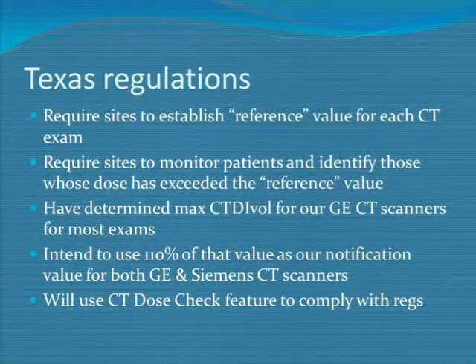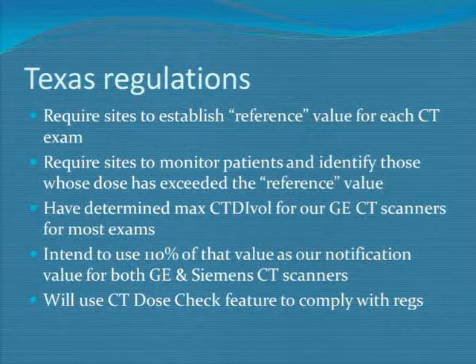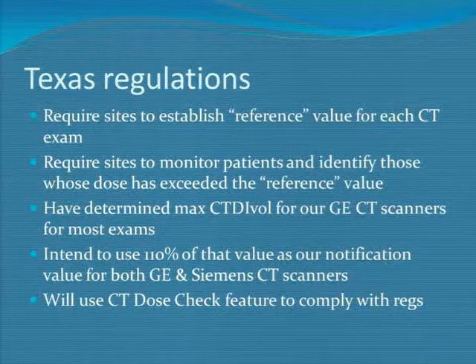Those of you from Texas are very well aware that our regulations changed as of May 1st, and now the state of Texas requires us to establish reference values for each CT exam. We have to monitor our patients and identify those patients whose dose value has actually exceeded this reference value.